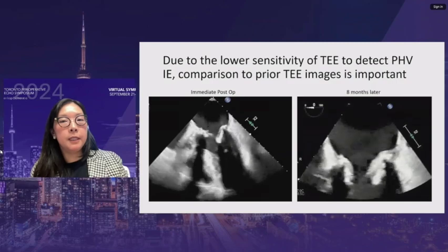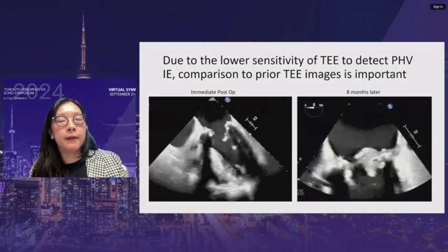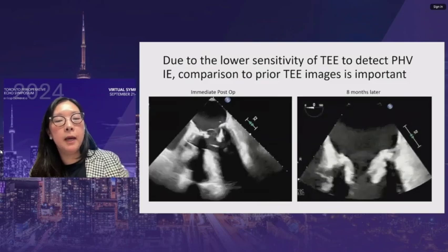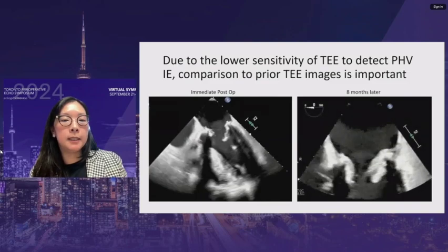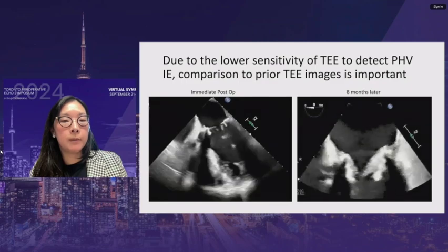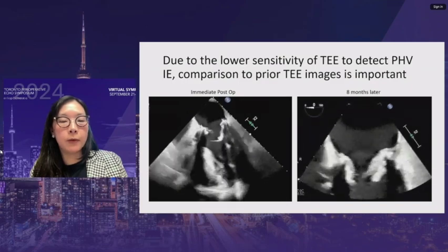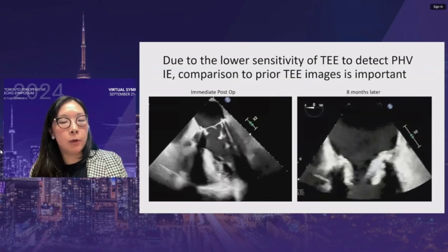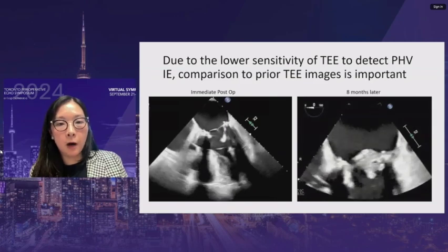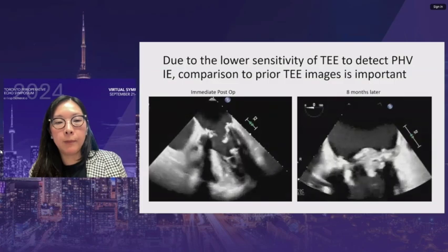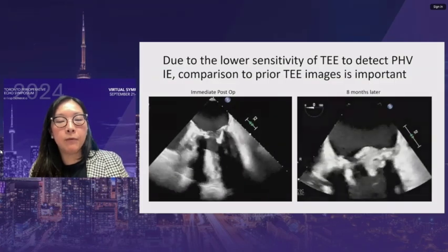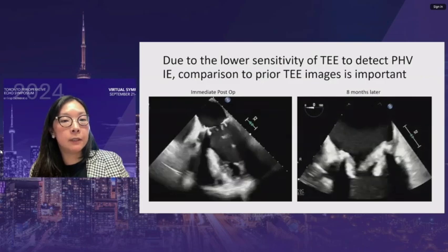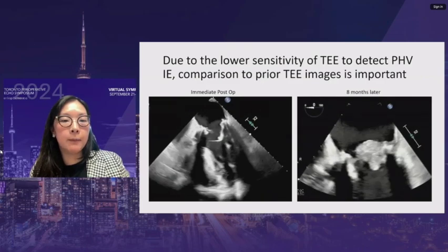Due to the lower sensitivity of TEE for detecting prosthetic valve infective endocarditis, comparison to prior TEE images is important. An example shows the immediate post-op study with a normal bioprosthetic mitral valve contrasted with the infected valve on a subsequent study. Post-op images should be reviewed before scanning to distinguish sutures from vegetations that have grown.